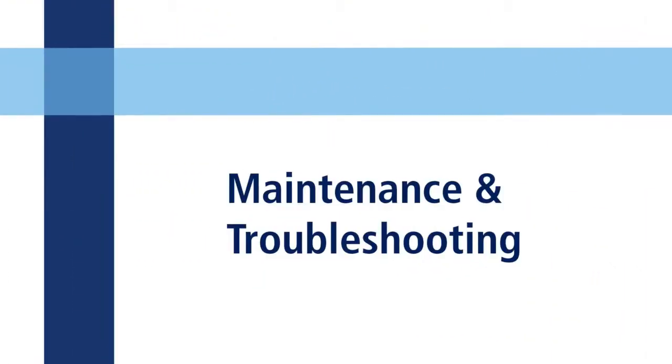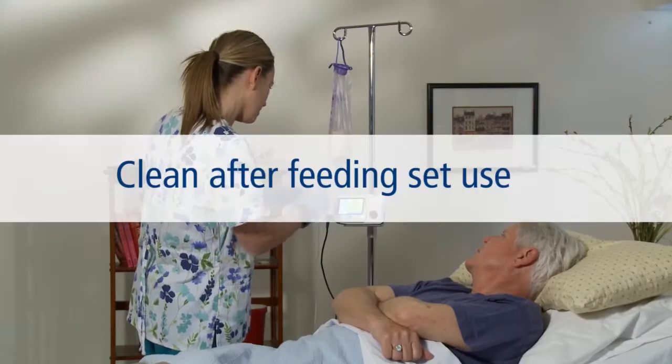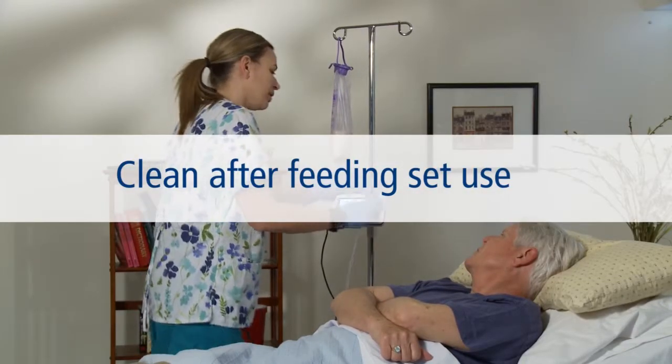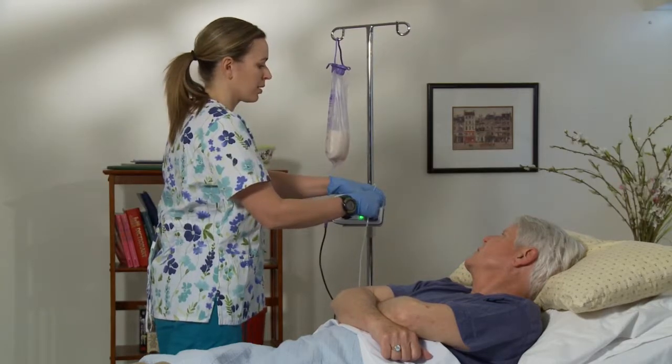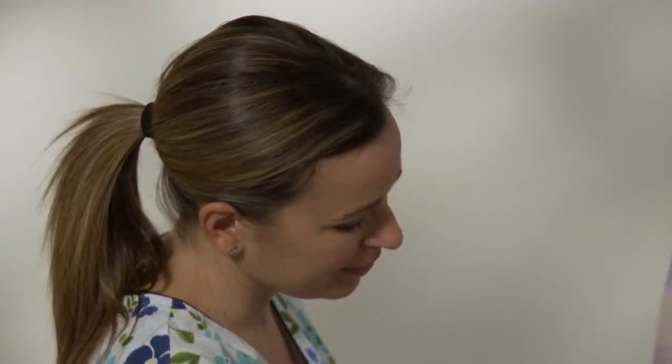Maintenance and troubleshooting. Please see the operator's manual for complete cautions, instructions, and appropriate cleaning solutions. It is recommended that the pump be cleaned after each feeding set use to prevent bacterial contamination of the pump. Further, failure to clean the pump can interfere with the function of the pump rotor, which can increase the occurrence of errors and warning alarms.